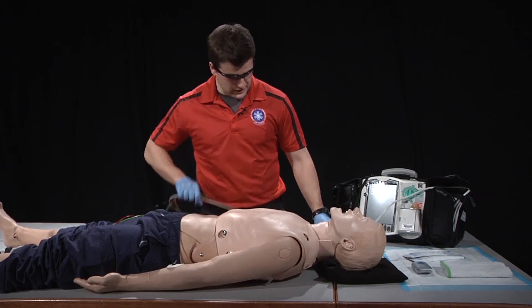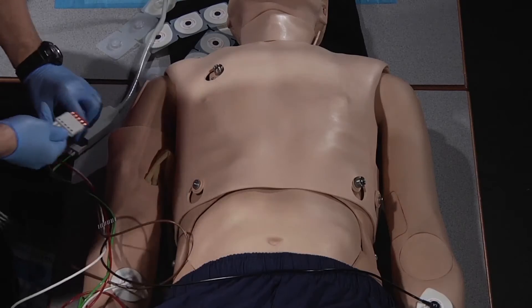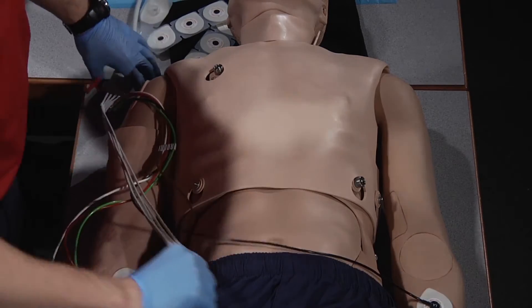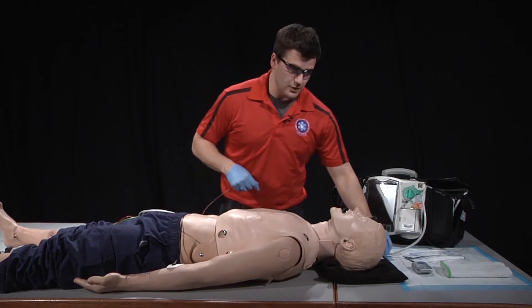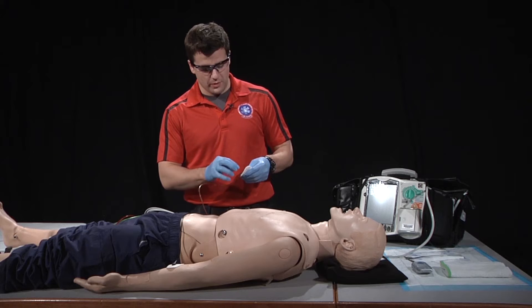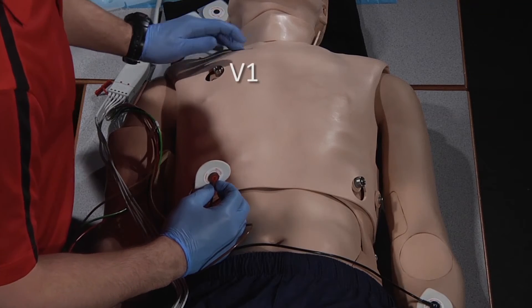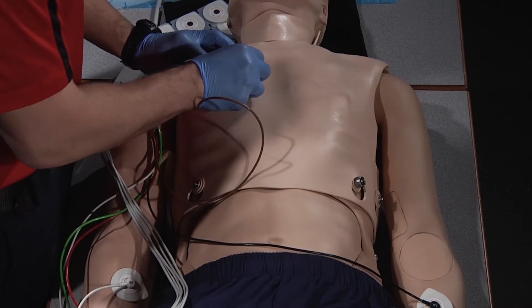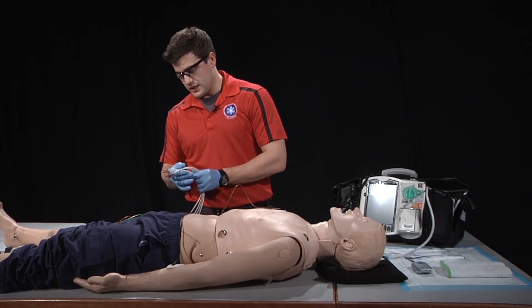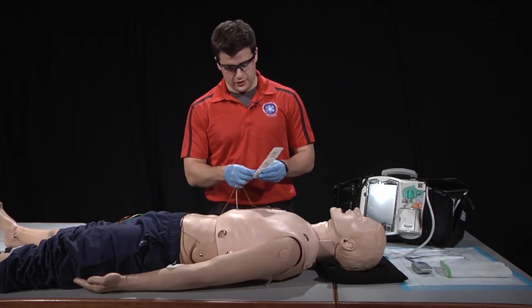The first precordial lead we're going to place is V1. V1 is going to be placed to the right of the sternum at the fourth intercostal space. The next precordial lead we'll place is V2. V2 will be placed in the exact same spot, just to the left of the sternum.